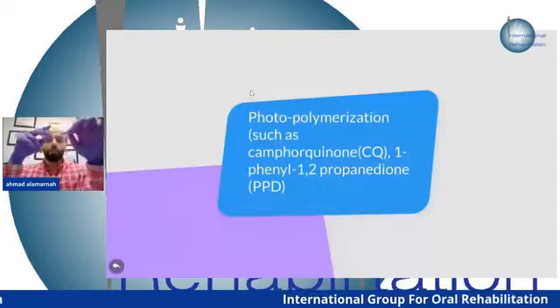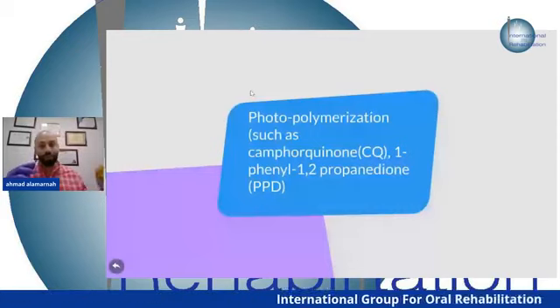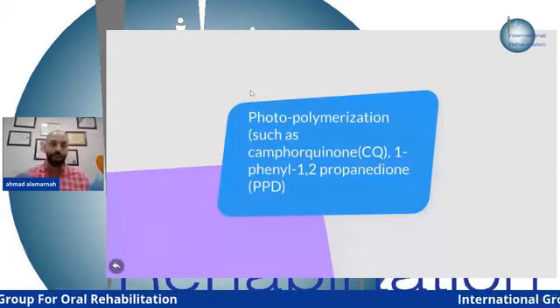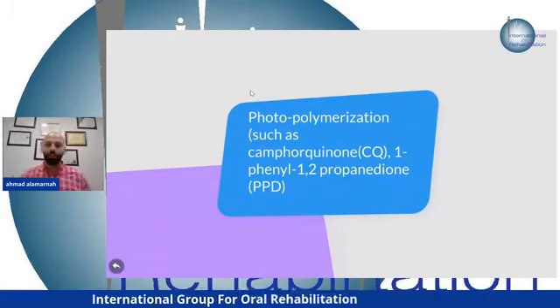Okay. This type of composite has two photoinitiators, okay? The camphorquinone and the propanedione that works with the violet light, okay? So it needs a different type of light cure that has the two wavelengths, the blue one and the violet one, okay? So you have to read all about your composite. If you cure it only with the normal light cure, it will cure, but it will not fully cure. And later on, it will fade, okay? So you have to read all the instructions of your composite and its components, mainly the initiator, okay?